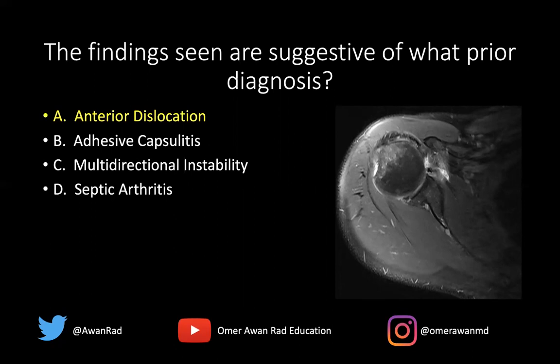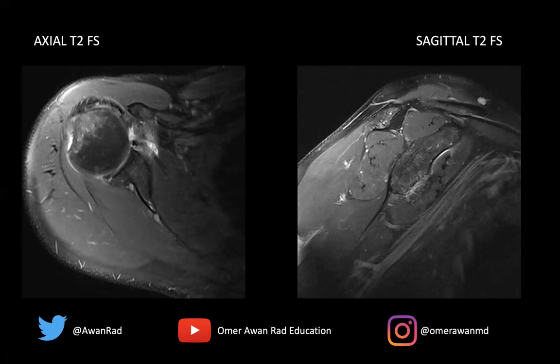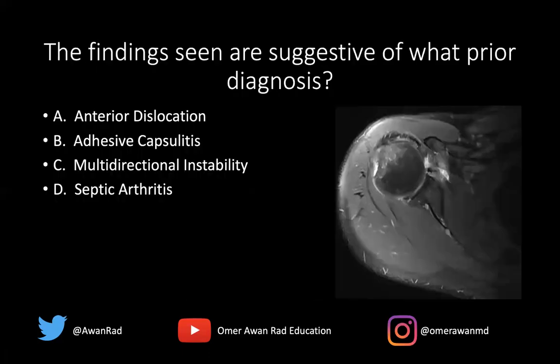Currently the shoulder is not dislocated. But if we come back to this image here, we can see that there's a defect along the posterior lateral humeral head along the axial image. We call that a Hill-Sachs lesion. And along the anterior inferior glenoid, there's a Bankart lesion. This pattern of injury suggests that this patient must have had an anterior glenohumeral joint dislocation.